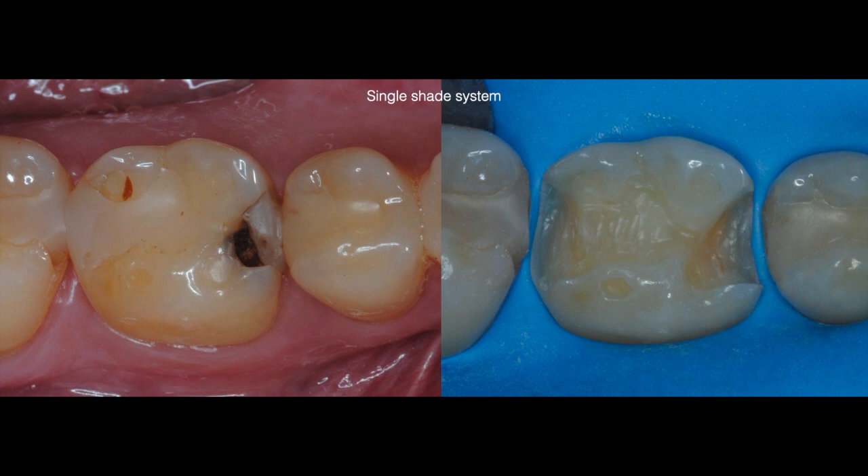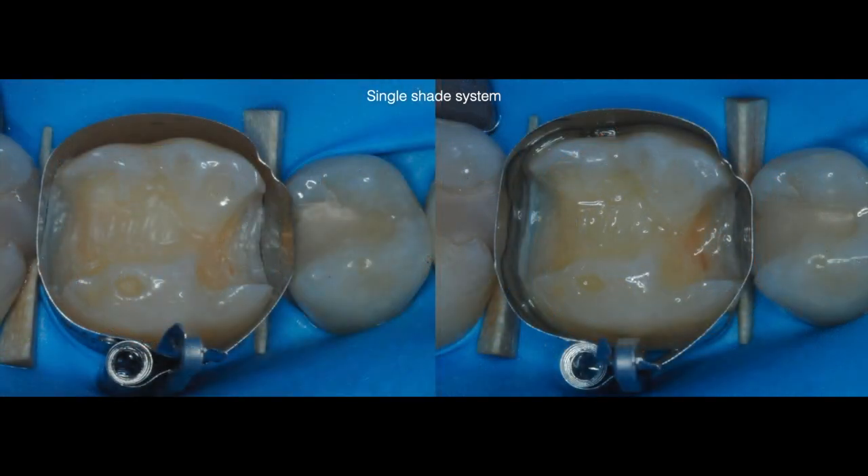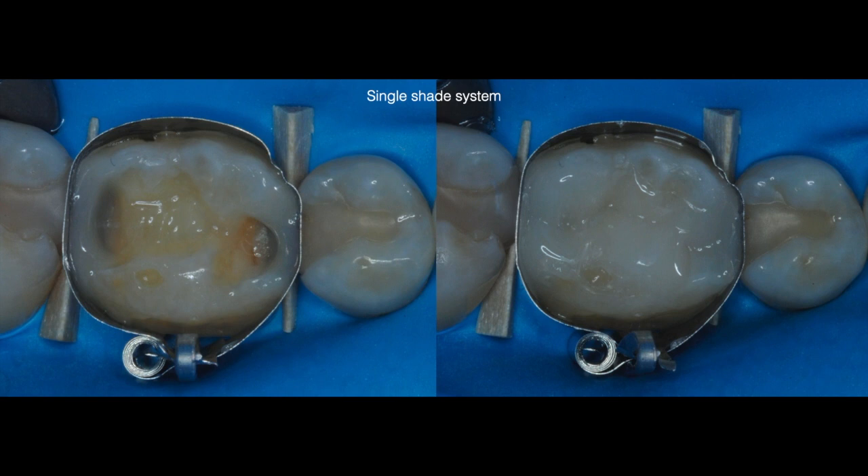In this case I will be using Omni Chroma to restore this large class 2 on tooth number 30. After placing my matrix band and wedges I selectively etched, rinsed and applied the Universal Bond by Tokuyama, which is a self-cure bonding system, and then completed my restoration using a centripetal technique as seen on the photos.